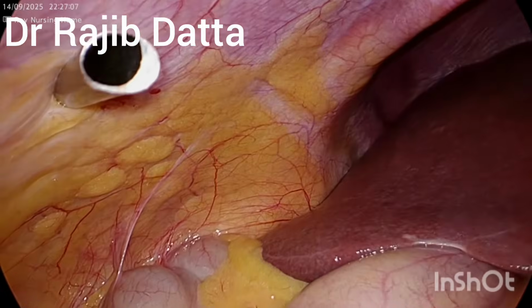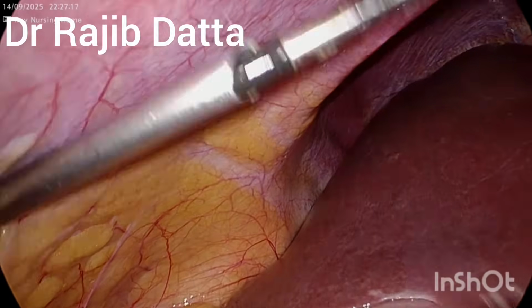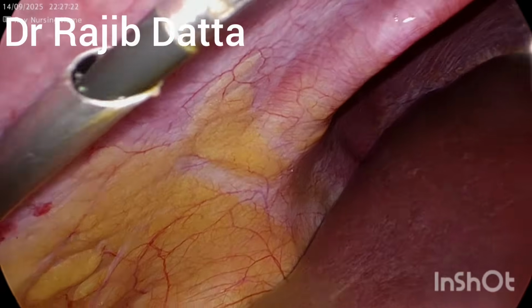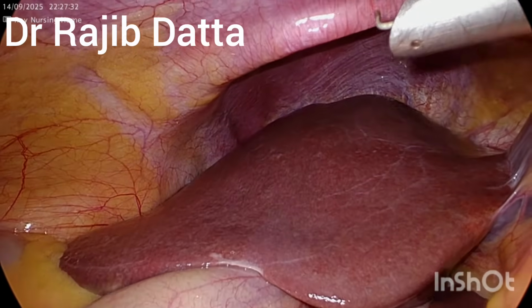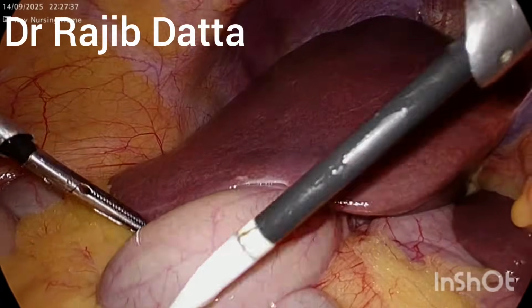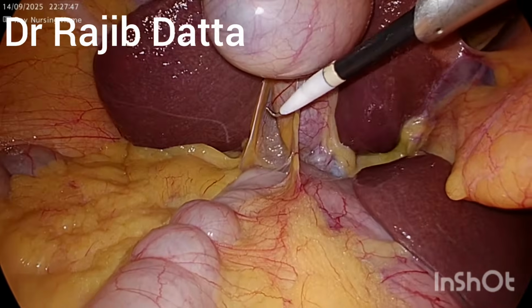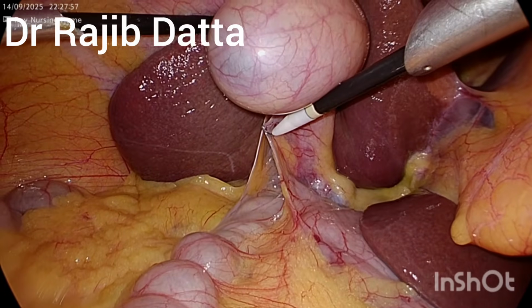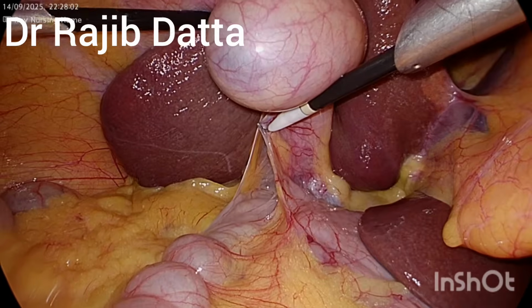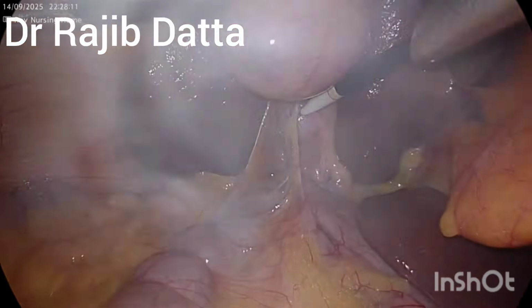And you can see the distended gallbladder. The wall of the gallbladder is quite similar to the wall of the gut. The color here is quite similar to the lumen. So now we are going to introduce our monopolar hook. The first job is adhesiolysis, which is going on. Here the omentum has been adhered near the base, and the stomach and part of the duodenum are well visualized.